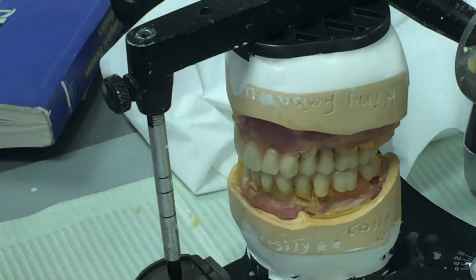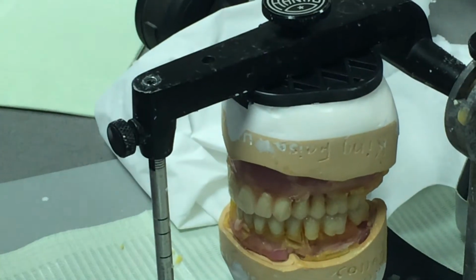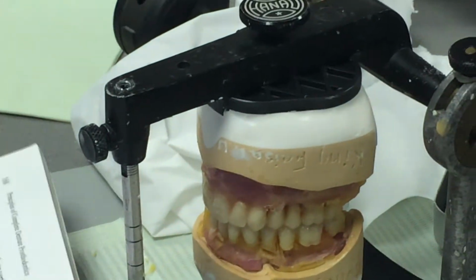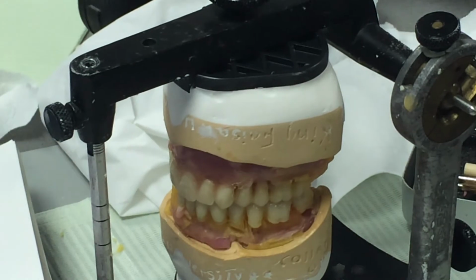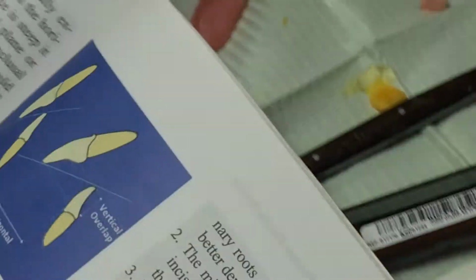There's something important we have to talk about because we start with the lower anterior. We have done already the upper anterior, right? So lower anterior, how it has to be.